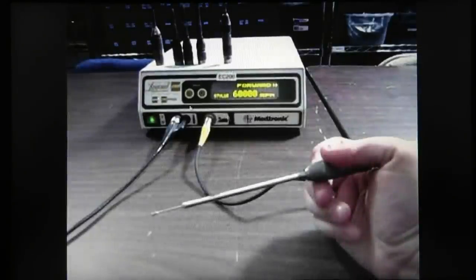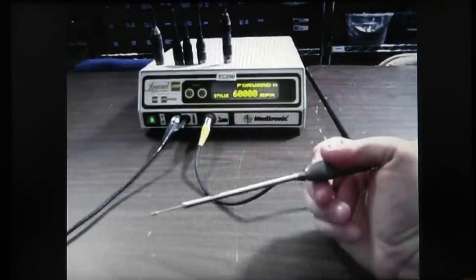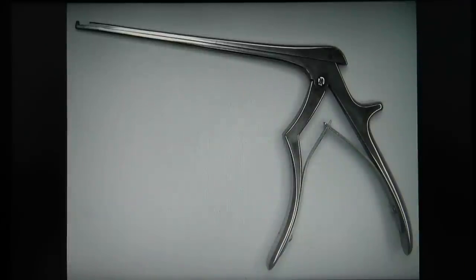In the last three or four years there's been an electric burr — no hoses, no tanks. In my opinion it's much easier and safer because there's no kick and the hose doesn't explode. You still have to be careful — it's a high-speed burr at about 60,000 revolutions per minute — and you control it with a foot pedal.